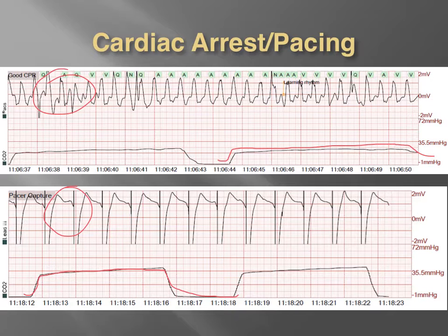Maybe there is a vessel blocked in the coronary arteries that is causing conduction delay, or inhibiting conduction all along. So it's always possible that we have a savable patient. We could just pace them going into the hospital, and this is a great indication that our pacing is actually working and that we're getting great capture for sure, not just feeling pulses.